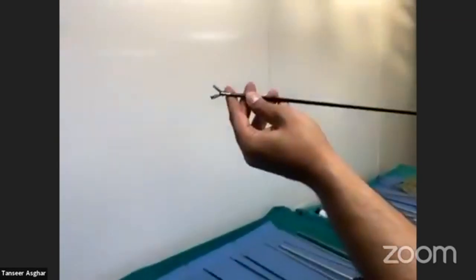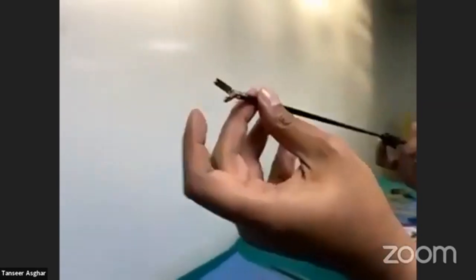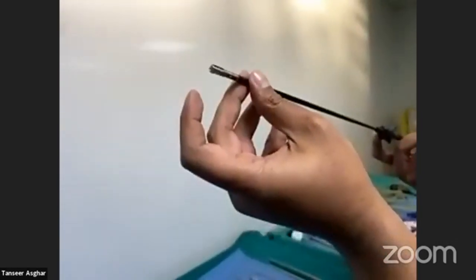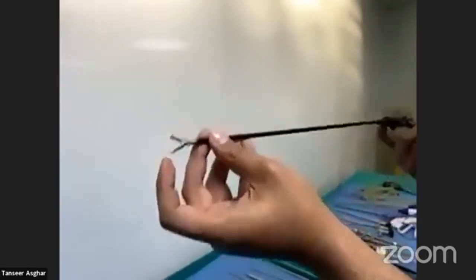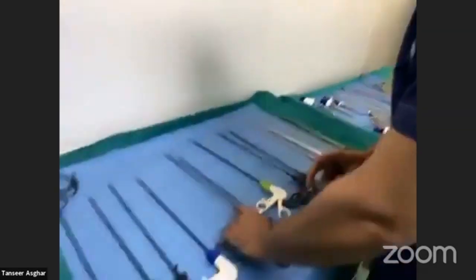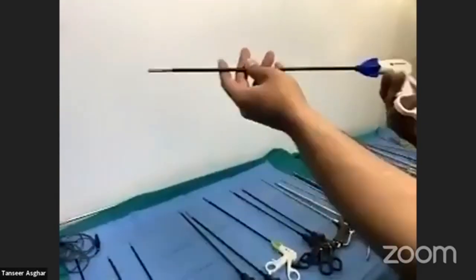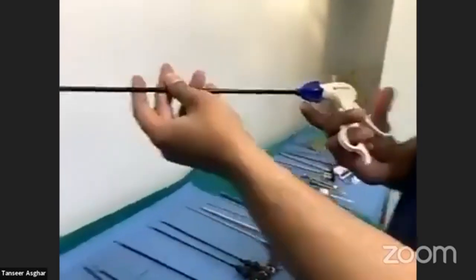This is another grasper with a very sharp edge, used to hold viscera tightly or take small biopsies. It is without a lock. There is also another instrument with a lock and double-action mechanism.